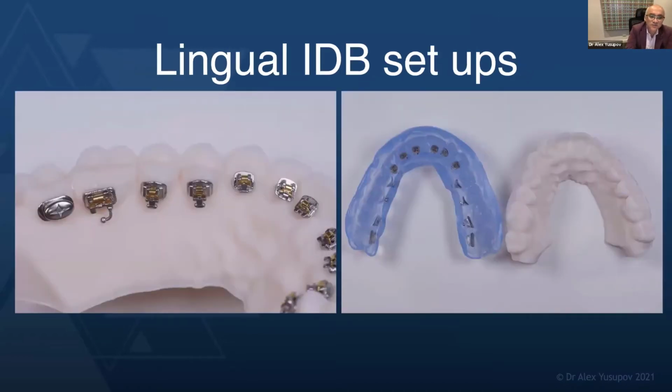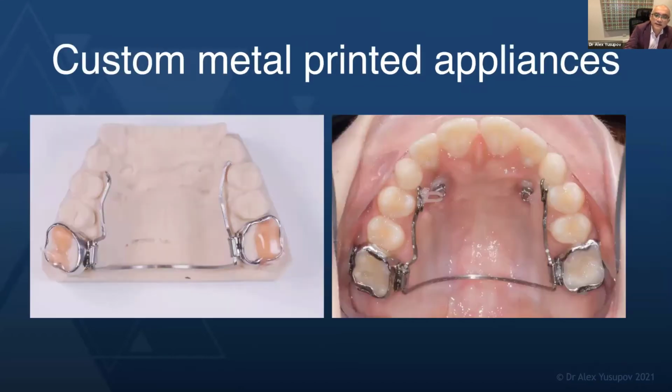IDB, especially lingual IDB, I do a lot of lingual work, and we used to pay thousands of dollars in setup costs and brackets, and today this has just dwindled down to a couple hundred dollars, and I can get this done under 24 hours, and if really at a push, I can do it under 2 hours if I want to. Designing appliances that are patient specific has been just incredible.